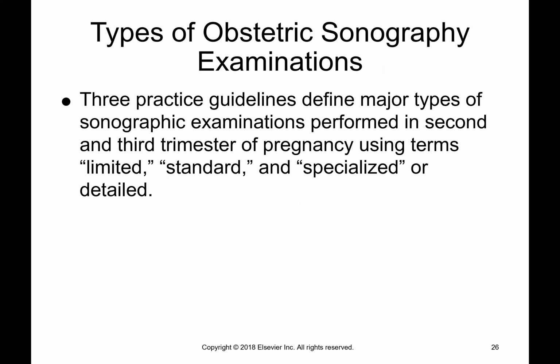So as we went through that list, you can see that there are a lot of reasons why we do ultrasounds on a baby. And it just is such a helpful tool to assess fetal well-being. We do multiple different kinds of scans. We could do just a limited scan. If a patient just comes in and they want to see where the placenta is, and that's it, we'll just do a limited ultrasound for placenta.